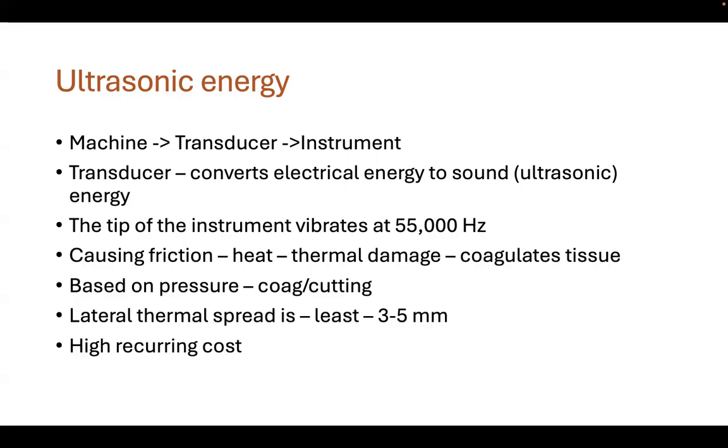Sound energy basically means vibrations here. So the transducer converts the electrical energy to the sound, which is in ultrasonic range. Why is it in ultrasonic range? Because the induction of this sound energy causes the tip of the instrument to vibrate at 55,000 hertz per second. It's a very high value.